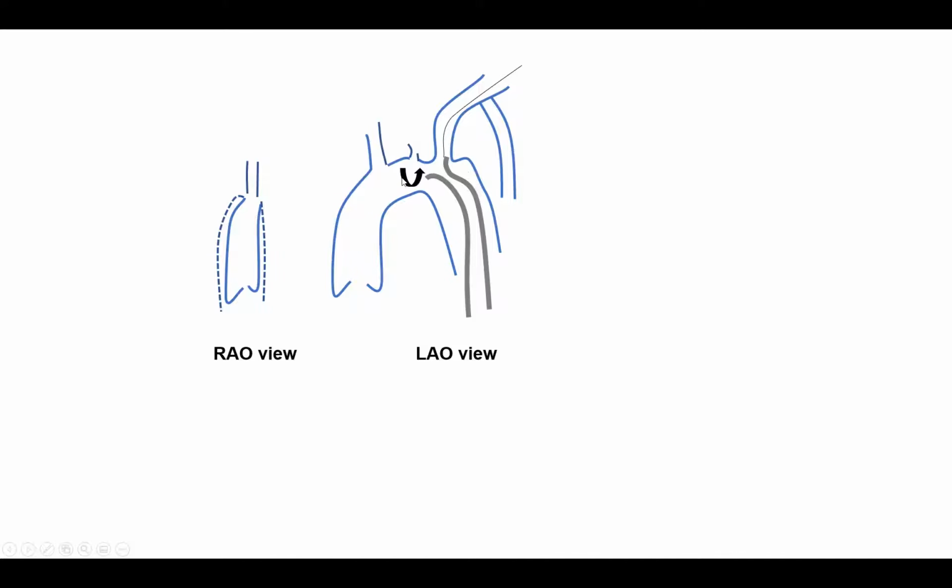Another technique, if you're hooked in one of those, is to pull it straight in that direction and get into the left subclavian. It is generally advised not to do that technique because you don't want to scrape atheroma from the aortic arch and embolize and cause a stroke. In general, though, the risk is very low, and in a difficult case, that may sometimes be the only thing and the most expedient thing to do, to just pull it straight and get in the left subclavian. Again, that shouldn't be your first line approach, but that sometimes is something we have to do. Did everybody understand how we can get out of a carotid and get back in the left subclavian?